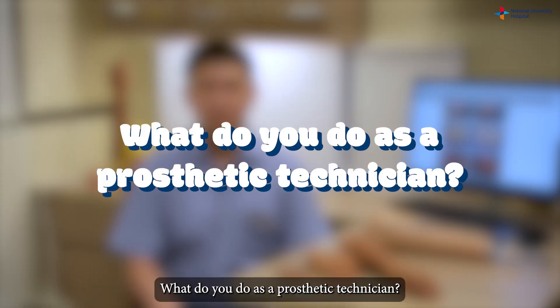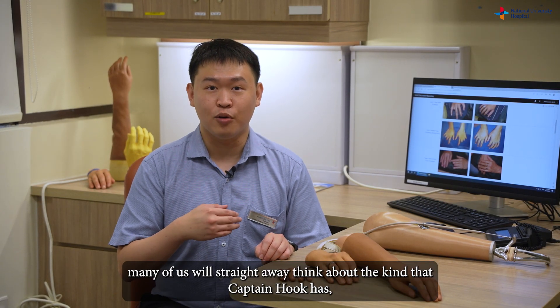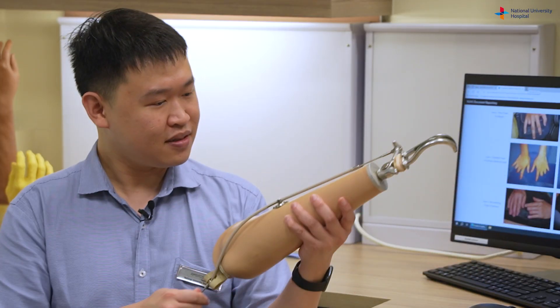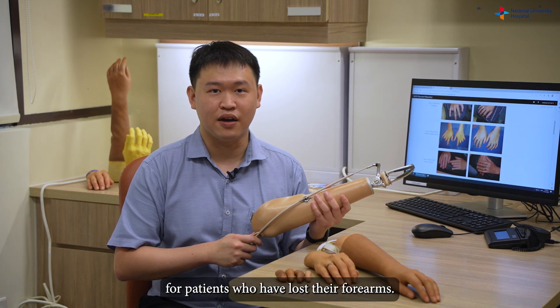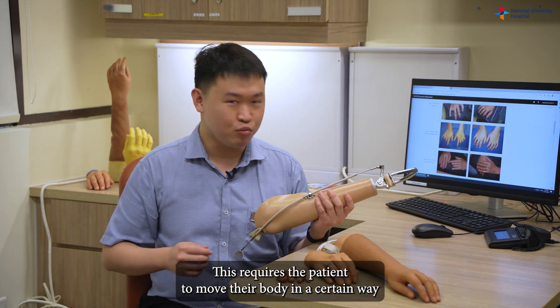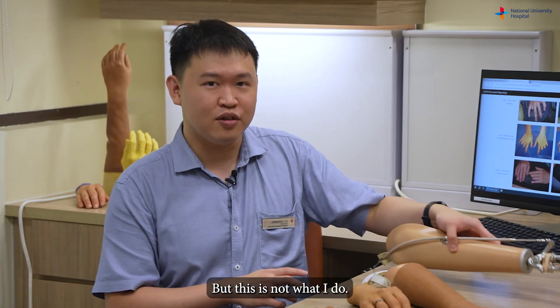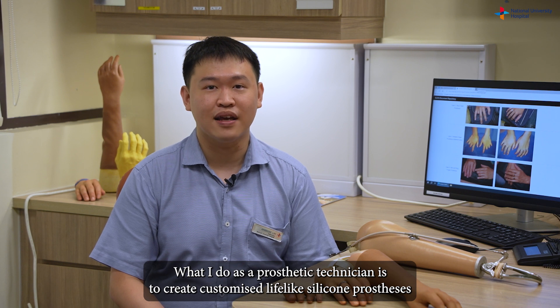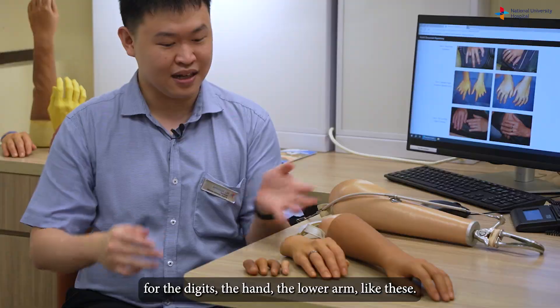When we talk about prosthesis or artificial hand, many of us straight away think of the kind Captain Hook has, which would look something like this. This is what we call a functional prosthesis for patients who have lost their forearm — it requires the patient to move their body in a certain way to grab things. But what I do as a prosthetic technician is to create customized lifelike silicone prosthesis for the digits, the hand, and the lower arm, like this.